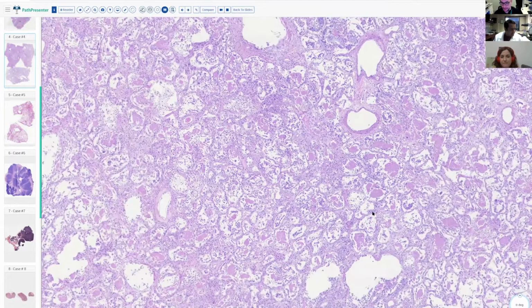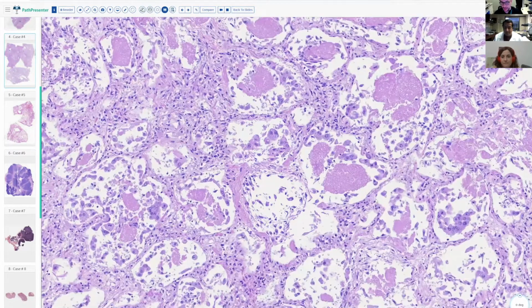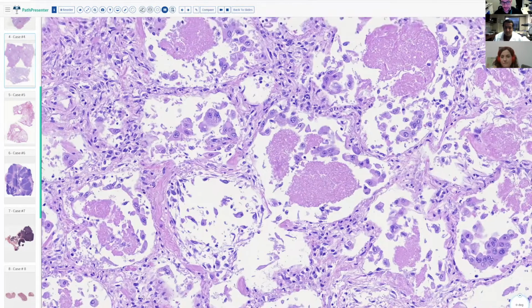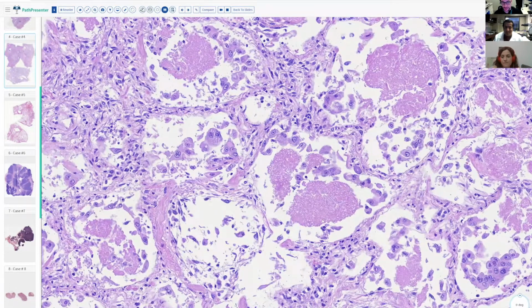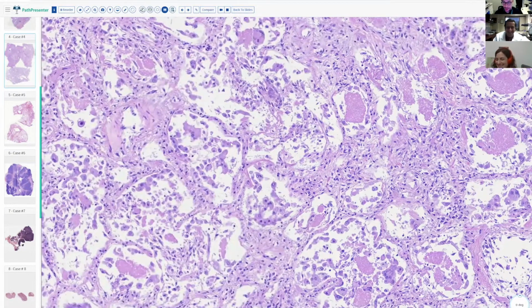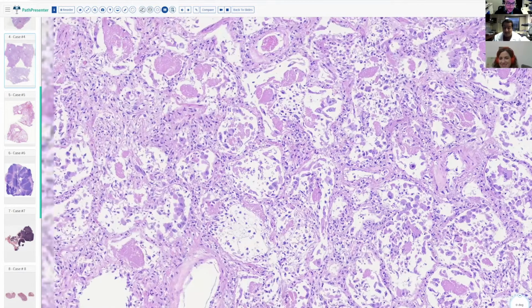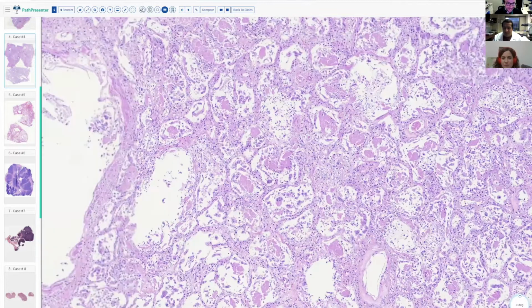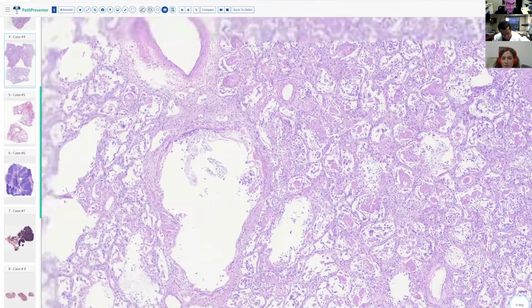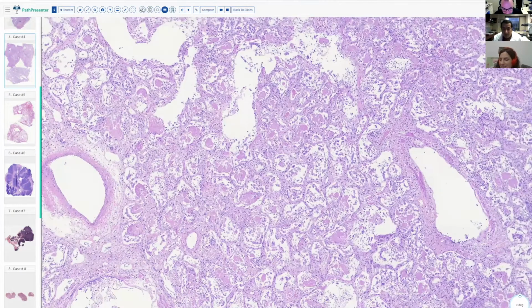So I believe this is an autopsy case here. And then we have areas that look like this. Irene just posted one like this on Twitter. I know, but this one highlights an important point. There's actually 2 diagnoses here. Yeah, like in her case. Actually, hers might have had 3. Well, no, I think I saw what Matt meant.